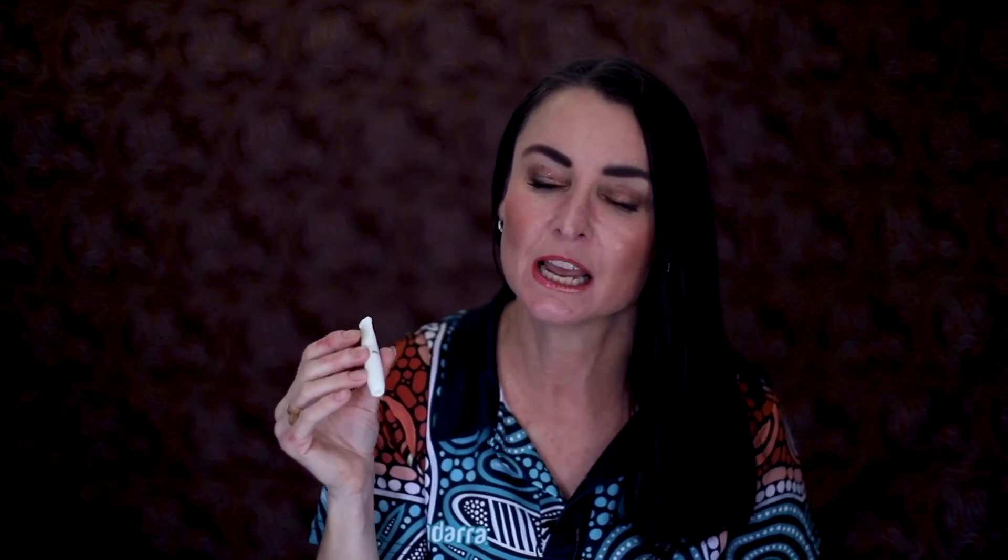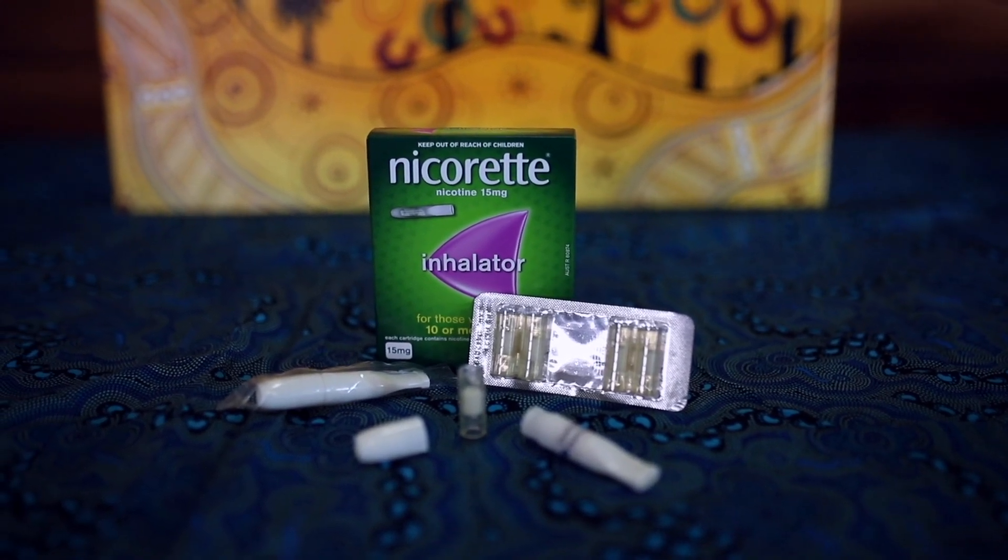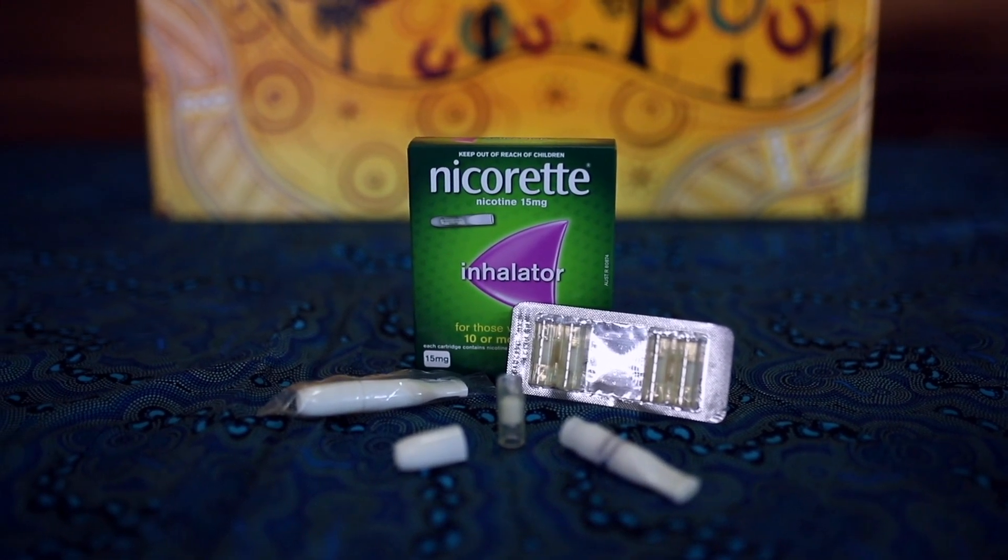It's best to keep your mouth closed afterwards to allow the nicotine to absorb in. When you first put a cartridge in it can taste a little plasticky but that does go away as you continue to use your cartridge. You'll know after that 20 minutes that there's no taste remaining and the nicotine's fully used up and it's time to pop a new cartridge in.